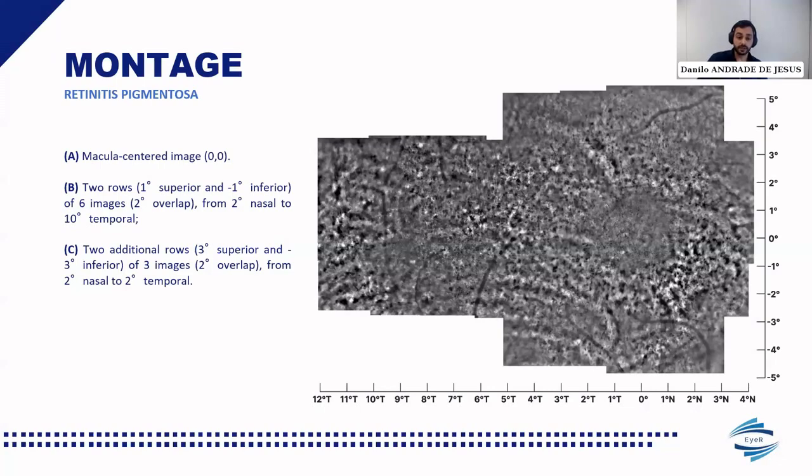Imaging of IRDs with adaptive optics holds great potential for research and clinical practice. But as we know, it's still in its early stage. This means that when we started the project, more or less 2 years ago, and to the best of our knowledge, there were no standard image acquisition protocols for IRDs published in the literature. Although there have been some interesting works published in this field, studies have always been adapted to their own needs and resource settings. So this raises the question: which protocol shall we use and why?